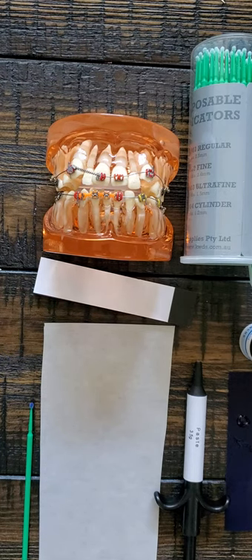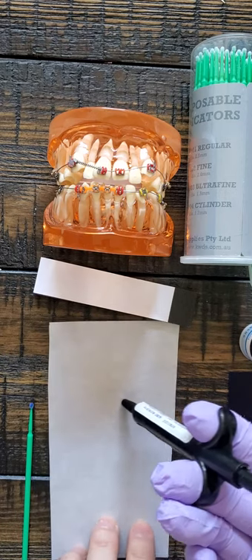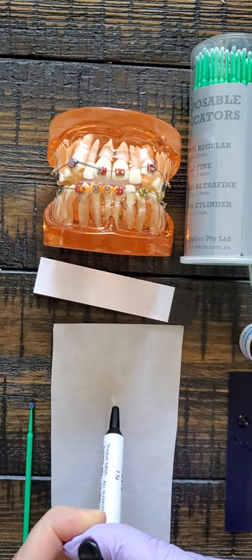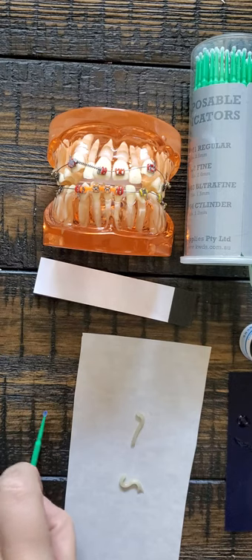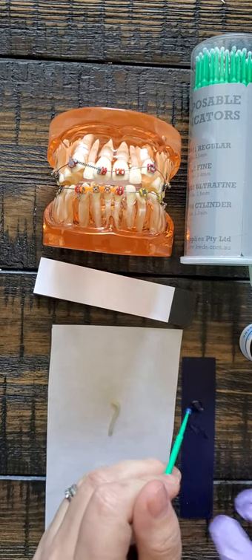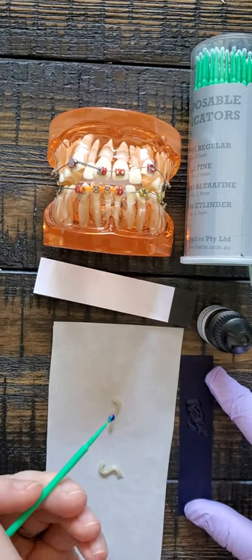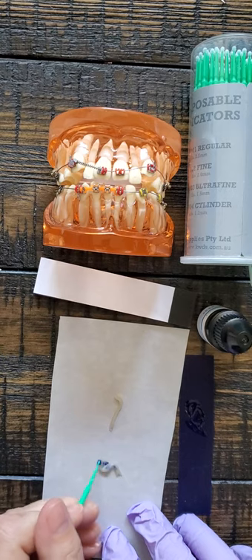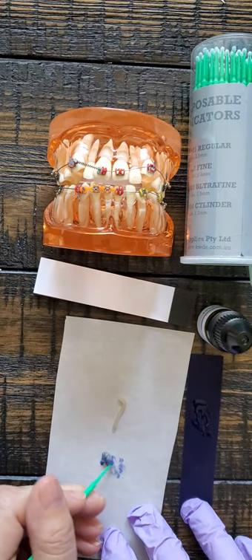Let's pretend we're putting bite bumps on this patient. We're only going to leave them on as short as possible — maybe one or two months — and we're going to color them so we remember to take them off. I go ahead and make my two little blobs of composite, express it out. Or you can just do one big one and split it in half. Here's my little trick: I take a piece of articulating paper — I like the blue side, not the red side, because the red side looks like blood. I put just a drop of primer on the articulating paper with a microbrush and mix it around. See how the microbrush is now blue? It's really easy, and then I use that to mix the composite.